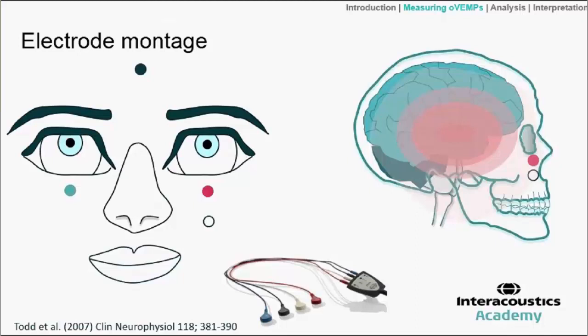But leaving that to one side for a moment, the point is this far field activity with two electrodes close together, one in the inferior orbit of the eye and then the other immediately below that, they would be expected to be affected or sense that far field activity very similarly. And of course one is inverting and the other isn't, and so the response will be flipped and then tend to cancel itself out. And so that's one way to attenuate that unwanted, in this test, far field auditory activity. But of course there are some caveats to that.